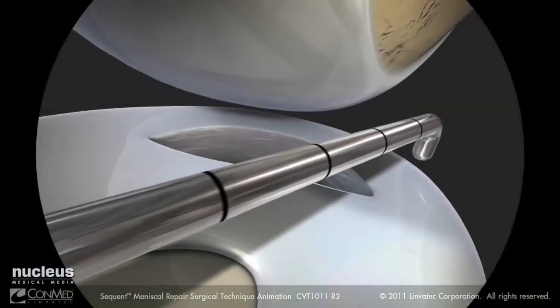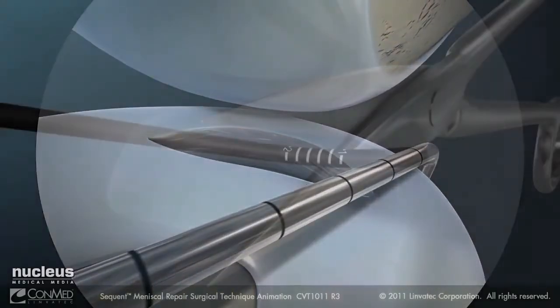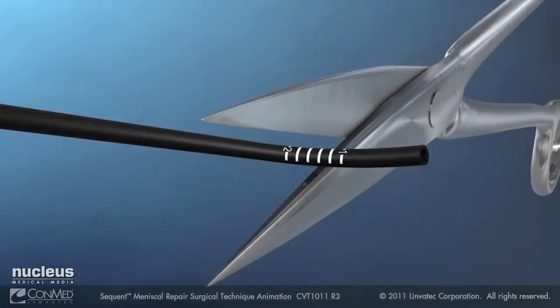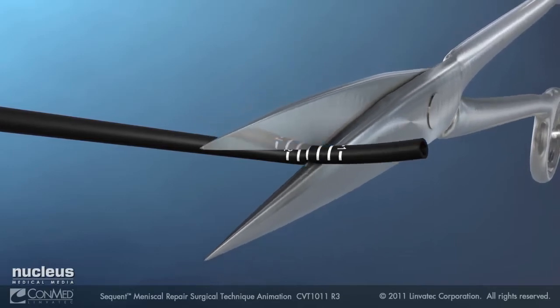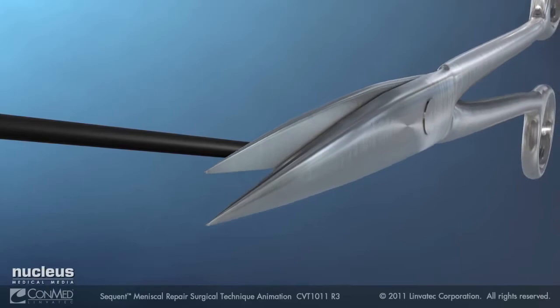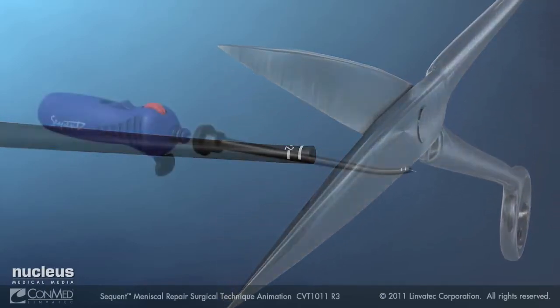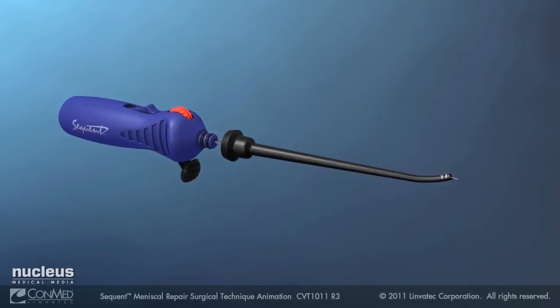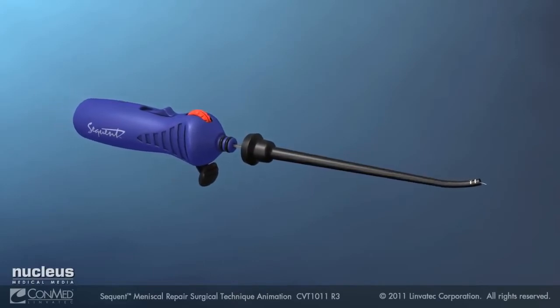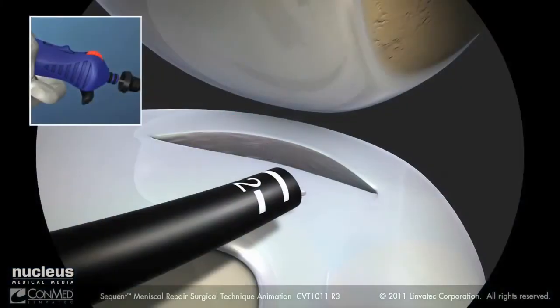Use a probe to approximate the deepest depth of needle penetration that will be needed. Cut the depth stop sheath to the appropriate graduation. Ensure that the depth stop will allow the needle to penetrate the meniscus at the deepest portion of the tear. Use the sheath as a protective entry cannula for entry of the meniscal needle into the joint space.